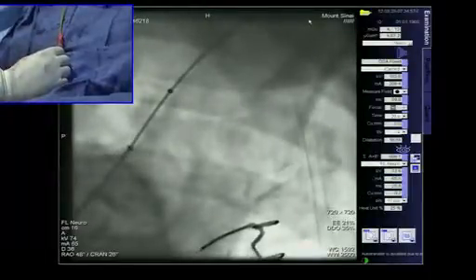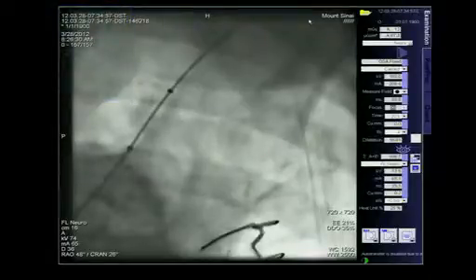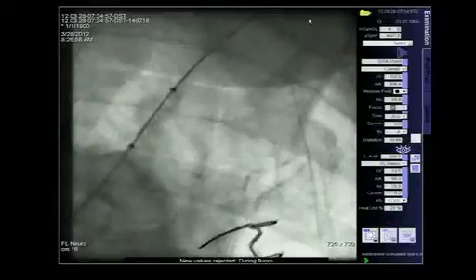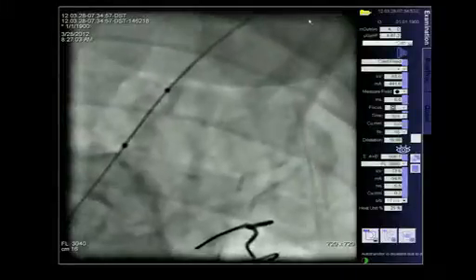And because of that, you're going to have to deal with a little bit of a pinch, and that's why we do what we do in terms of the CT. Give me a coronary now, guys. So now I'm going to put it on coronary, so this way there's no more breathing. Advance the sheath a little bit, because we get a more selective picture that way.